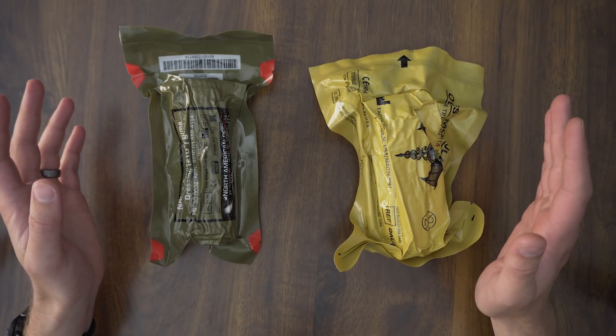So let's open these up and we'll take a look at how these are applied and the different features both have. So right away, if you're opening the North American Rescue, they've got the red tab and they call it a red tip technology. But really, it just shows you exactly where to tear to open it. And both are vacuum sealed.